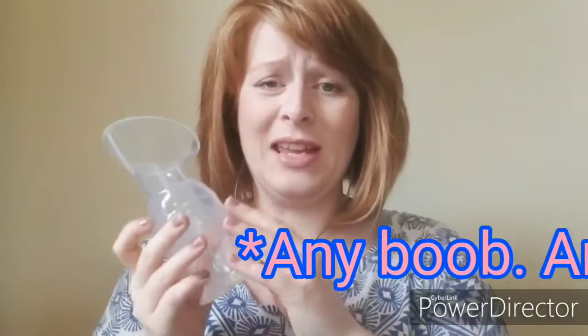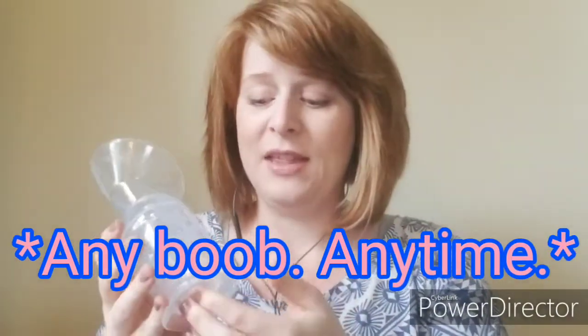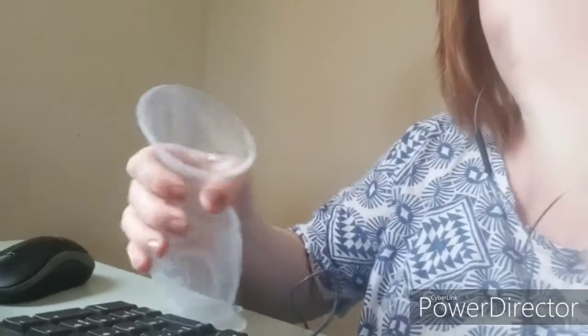It suctions to your breast right here. You could also use it if you're out and about — this is something way easier to carry in your diaper bag than a full-on electric breast pump setup. It's lightweight, it's small, it's discreet. And the bottom is also silicone because, for those of you who have ever pumped breast milk, spilling that stuff will just make you cry. So it has a silicone base to it as well.